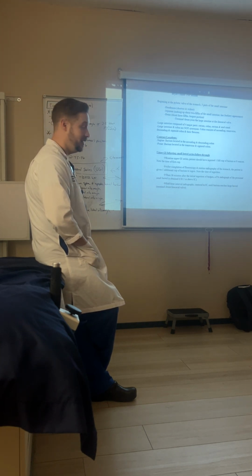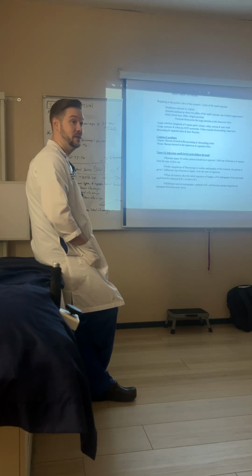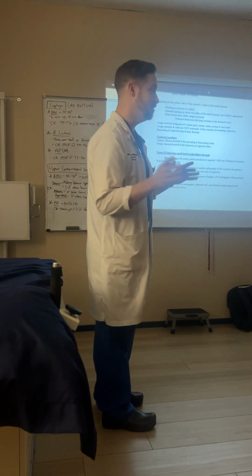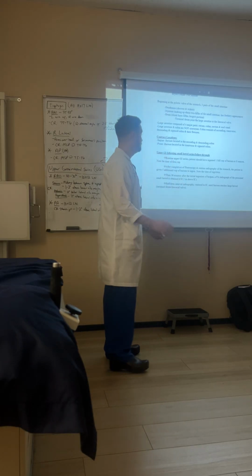The jejunum on imaging has what every textbook you will ever read and people that you meet say has a somewhat feathery appearance. It just looks a little fluffy and floaty. I don't know what they mean by feathery, but it has a feathery appearance.